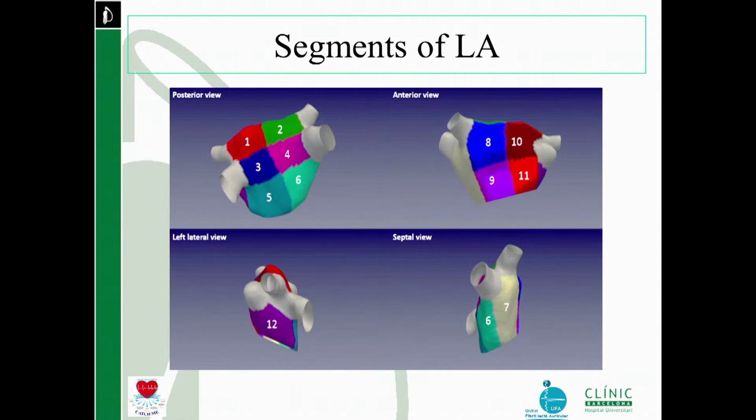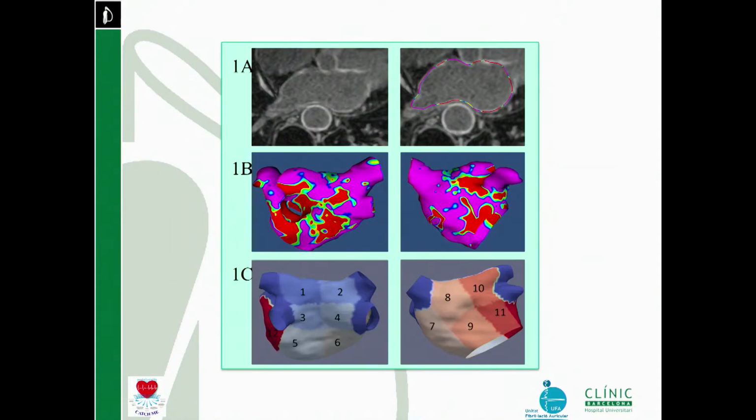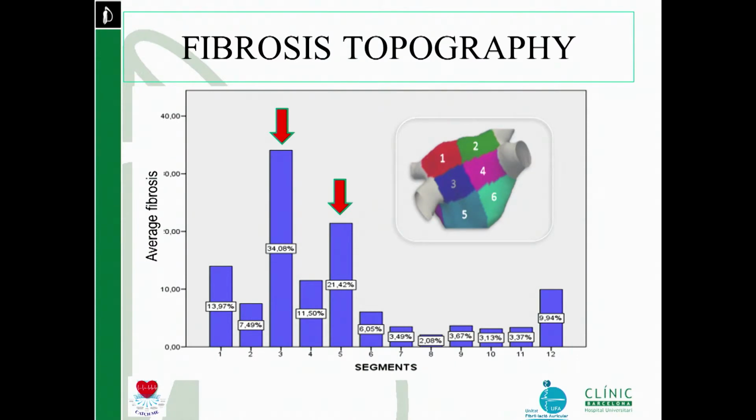And when we analyze that and we divide the atrium in several segments, that would be the left posterior and left inferior areas around the inferior pulmonary vein. And well, that's the process of analyzing that. So there's a fusion of the MRI with the software, etc. There's an engineering work on that that analyzes exactly where the fibrosis is located and the percentage fibrosis in each segment. This is something performed with a system, with a special software.